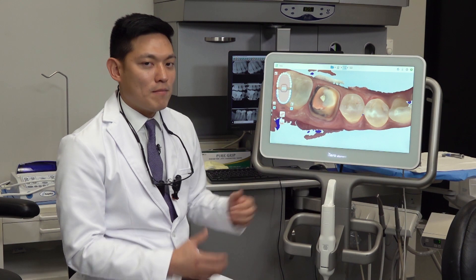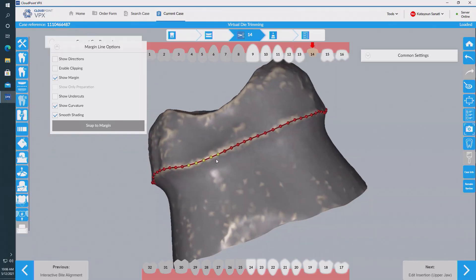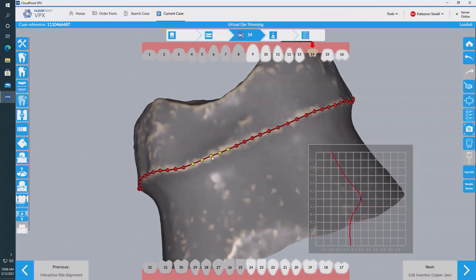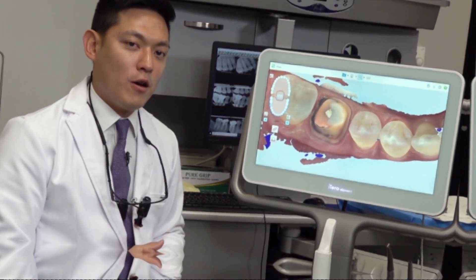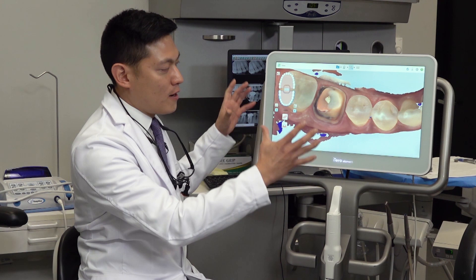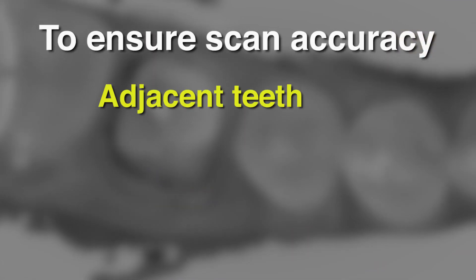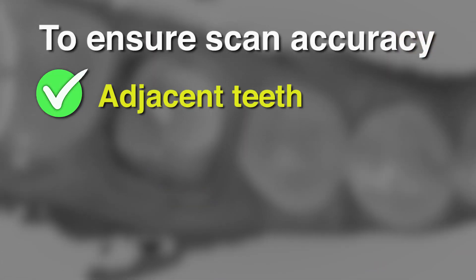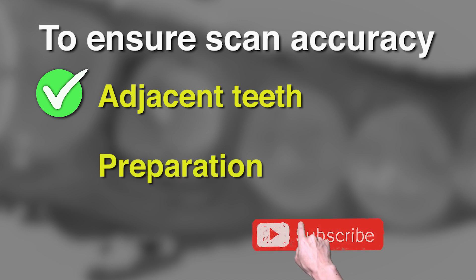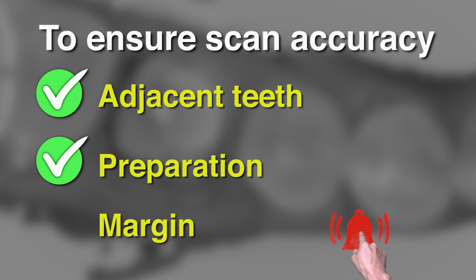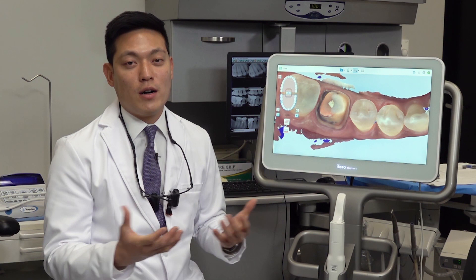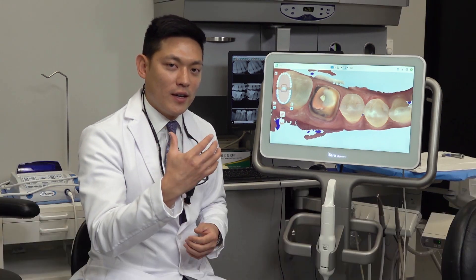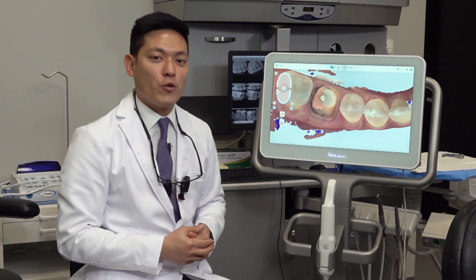If you cannot see the margins at this point on your digital impression, how can you expect someone else down the line — the dental technician — to know where to position the margins? So it's going to be very critical that those are also visible within your digital model. Analyzing the entire model, making sure that you have accurate data points over the adjacent teeth, the contact surfaces of the adjacent teeth, and the entire preparation — nothing's missing, everything is filled in correctly, and the margins are visible. That's how you can ensure that your prep model is accurate enough for a precise fitting restoration to be created on it.